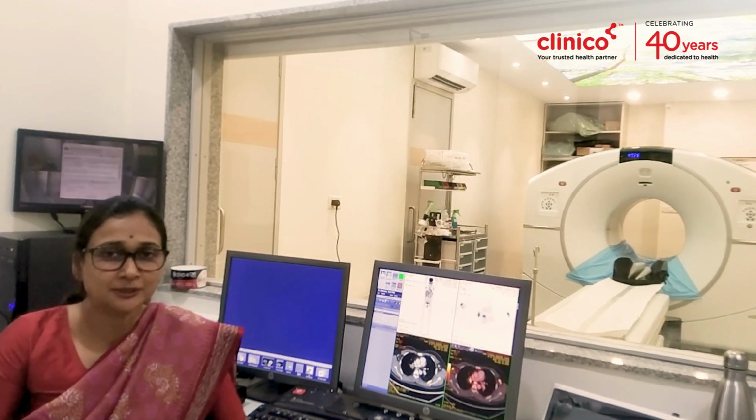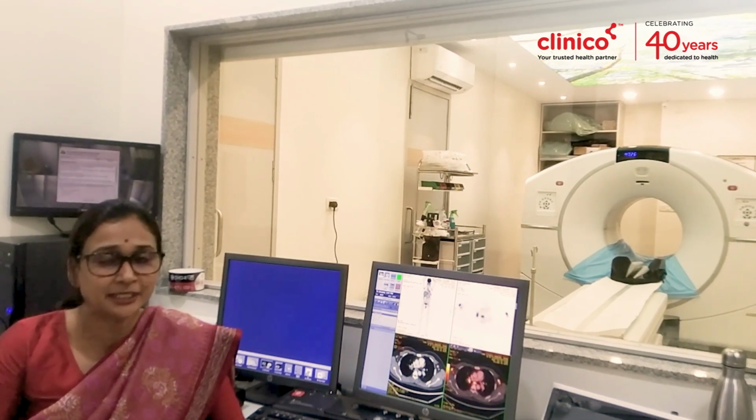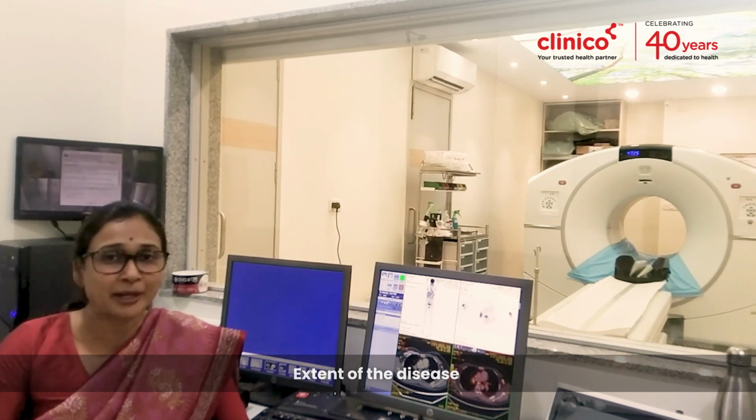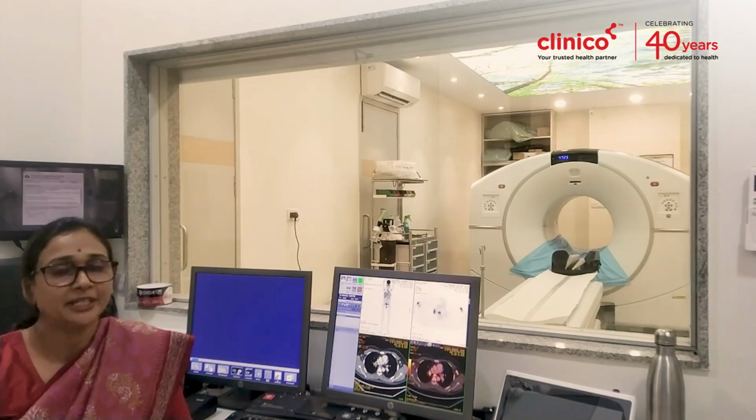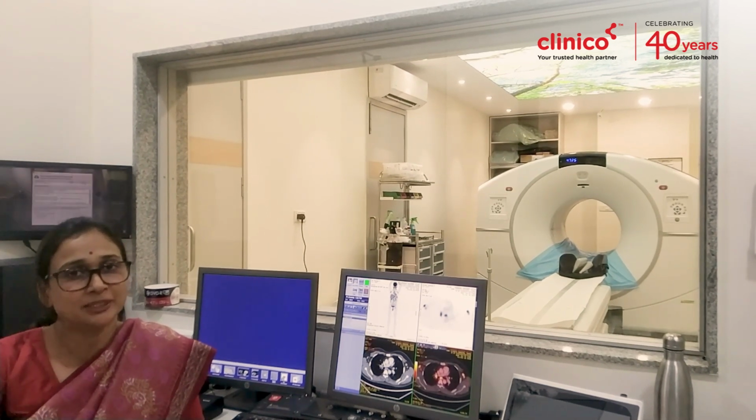In cardiology, it is used to evaluate myocardial viability, cardiac sarcoidosis as well as amyloidosis. In infections, it is used to diagnose the extent of the disease and the biopsy site. In cardiology, it is used to evaluate the myocardial viability.